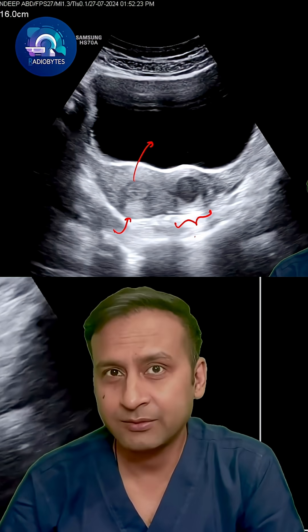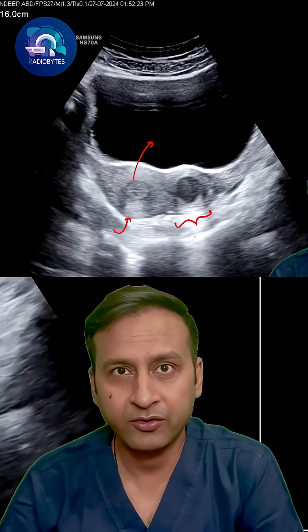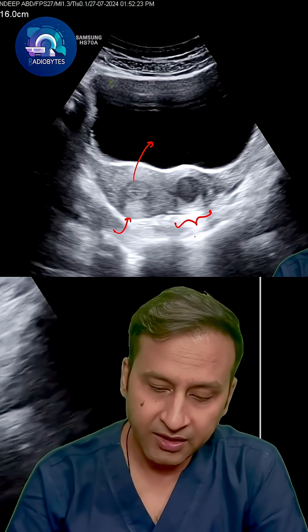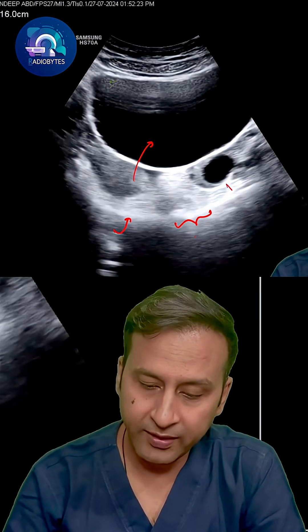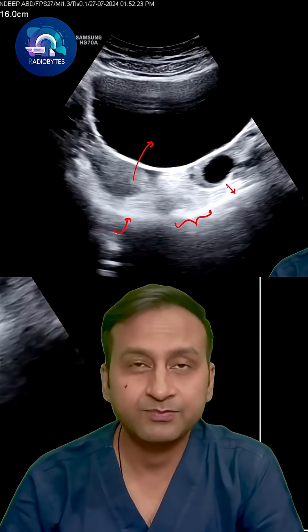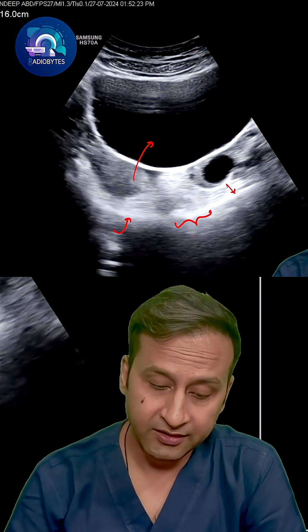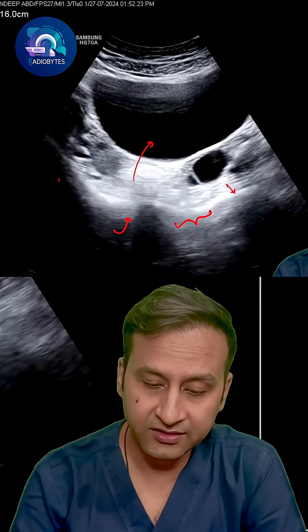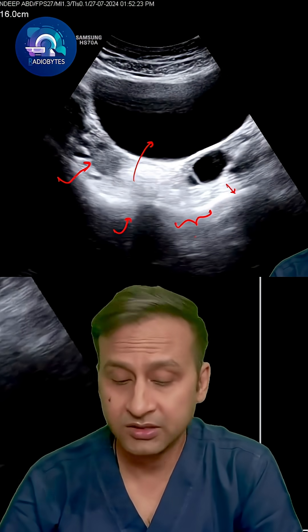The first thing that comes to our mind when we see a lesion in the periuterine location is something ovarian, but if you have seen the video carefully, the ovaries seem well separate from it. We can even see a dominant follicle in the left ovary, and when I'm going above I can see the right ovary also separate from it. So what is this lesion?